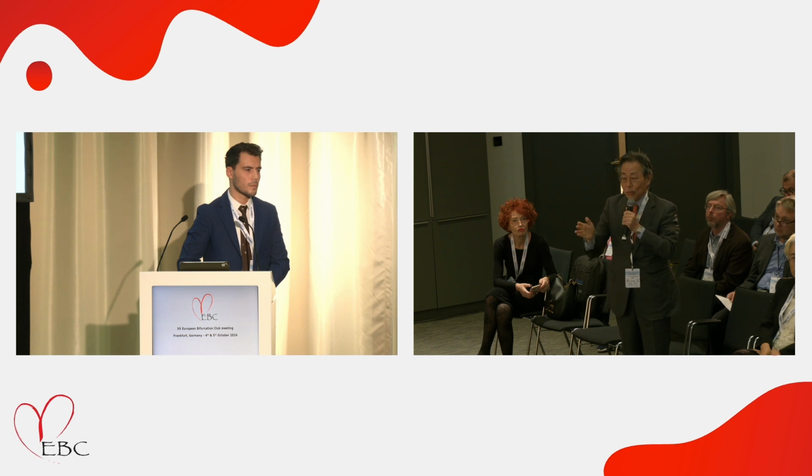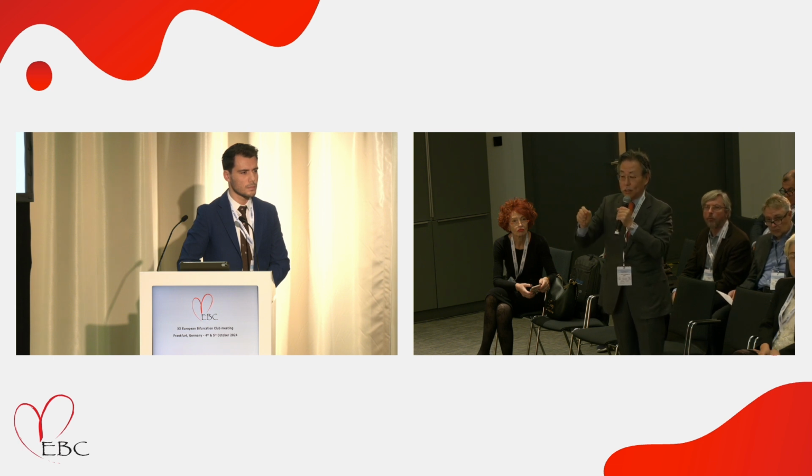So we recommend the short balloon for the side branch dilation, or proximal balloon edge dilation, for the POT-side-POT technique. In Japan, we already have a randomized study, POT plus side branch dilation with a short balloon and kissing balloon inflation. In this trial, that kind of malapposition occurred less frequently.